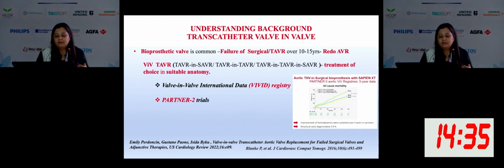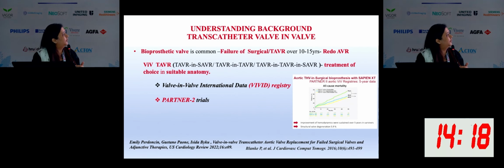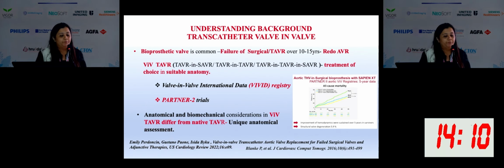There are a couple of trials which I have mentioned there, the VIV registry and the PARTNER 2 trial, which have shown that valve-in-valve TAVR has been the treatment of choice in suitable anatomy and high-risk surgical cases. So we started with TAVR in SAVR. Now we have TAVR in TAVR, TAVR in TAVR in SAVR. So there is a long spectrum of these valve-in-valves which have come up.